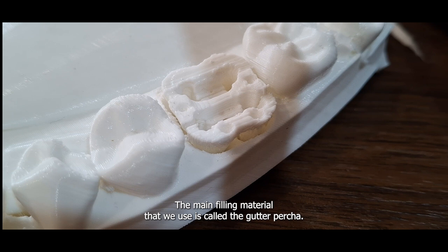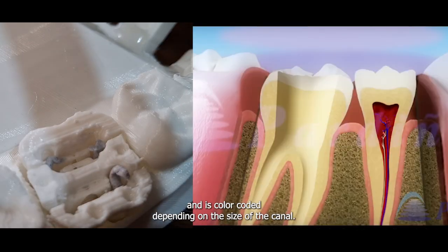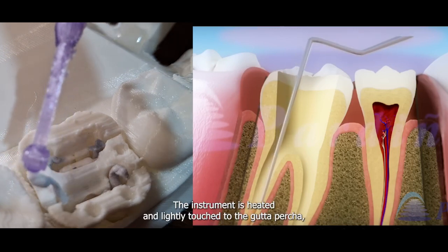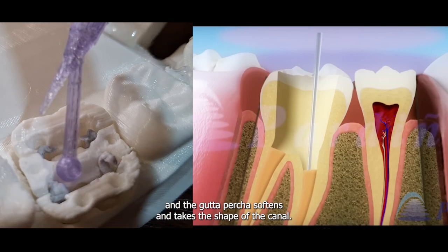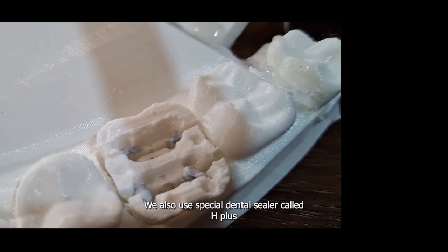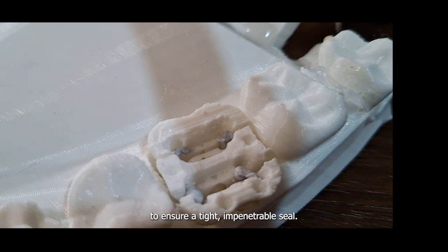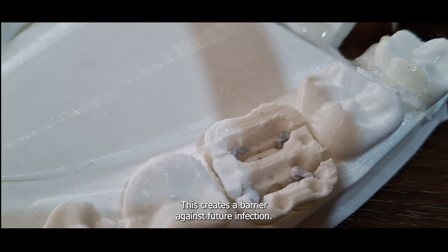The main filling material that we use is called gutta percha. It is a rubber-like material, perfectly biocompatible, and is color-coded depending on the size of the canal. The instrument is heated and lightly touched to the gutta percha, and the gutta percha softens and takes the shape of the canal. We also use a special dental sealer called AH Plus to ensure a tight, impenetrable seal. This creates a barrier against future infection.